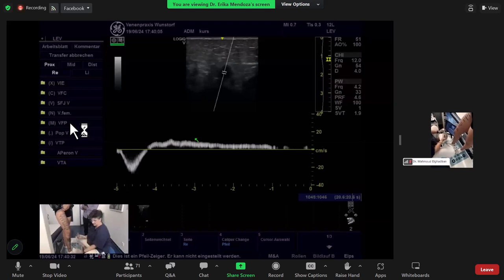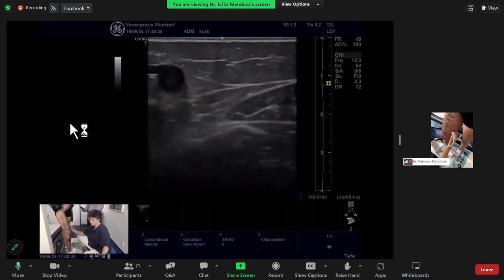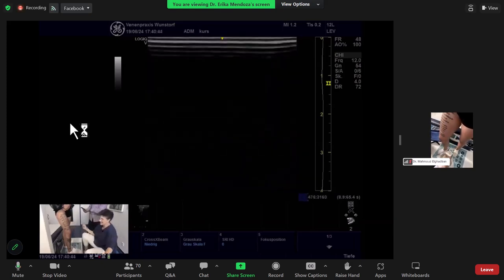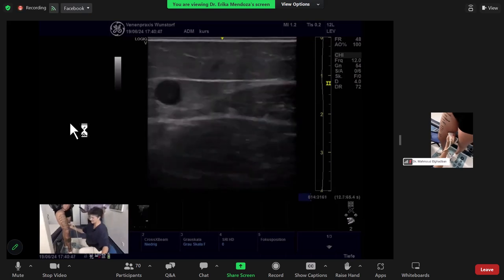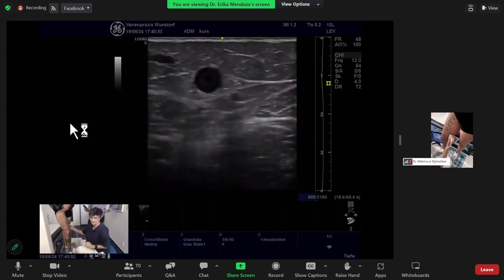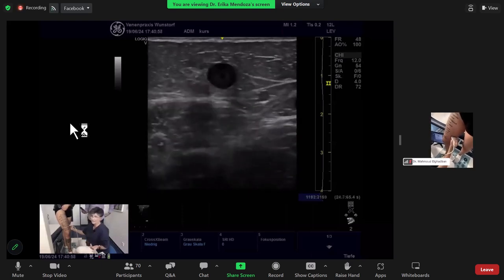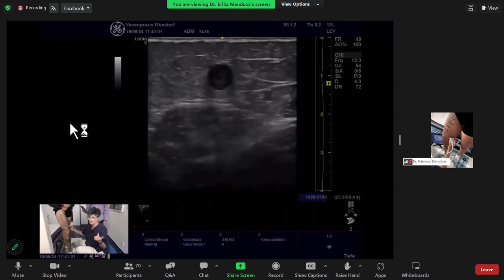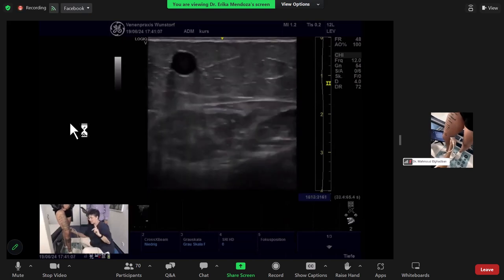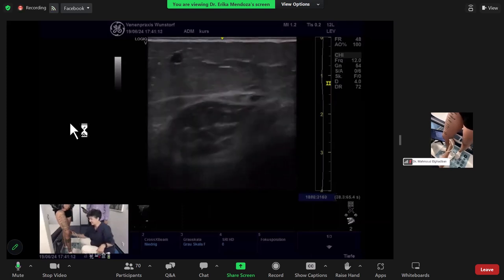Do you have a question? Yeah, we have a question. Someone said, can this be due to pelvic congestion syndrome, or is this unlikely to have a connection? I mean, pelvic congestion syndrome is not an ultrasound diagnosis, but a clinical diagnosis. This is a pelvic reflux, of course, because if it comes down the epigastric vein, it is pelvic. But the congestion syndrome means dyspareunia and pain and so on. So not every reflux coming down the pelvic veins is a congestion syndrome.